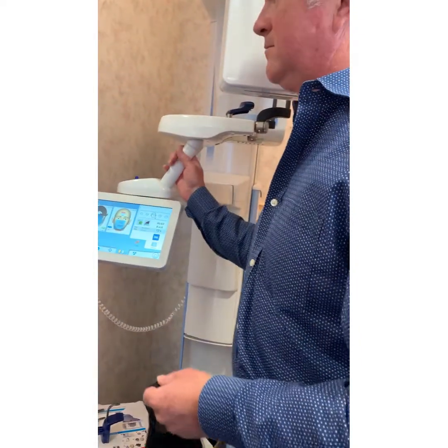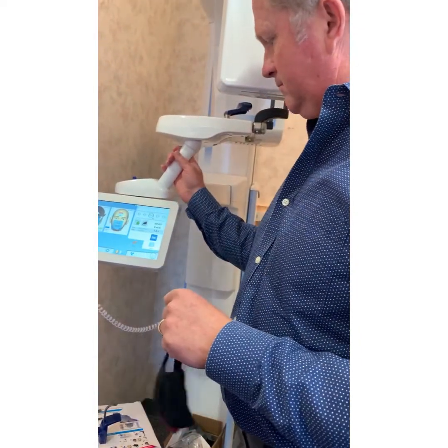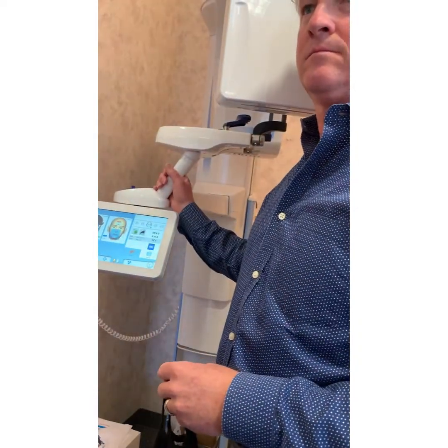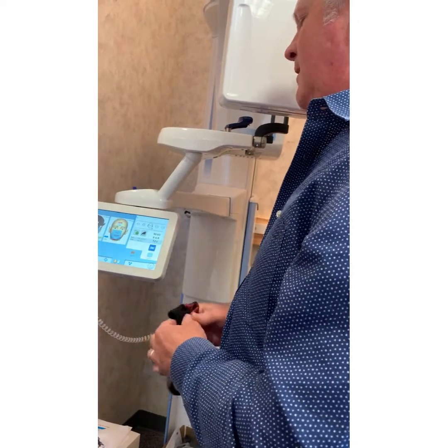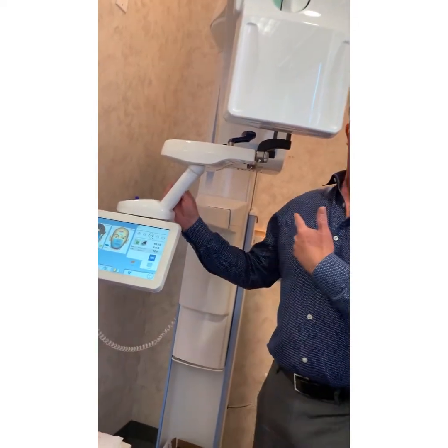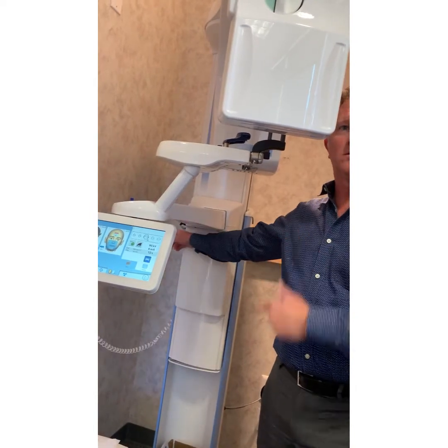So we have Pam here for her implant. We have to do a scan for her. Should we bring her back and do a trial on her? But is it moving right? It's not going to hit the wall. No, that's a discussion I have to have with Eric about. I'm going to recommend they move this over another 2 inches that way.